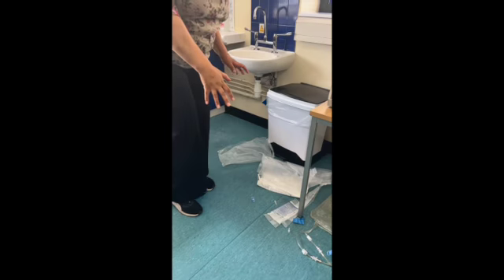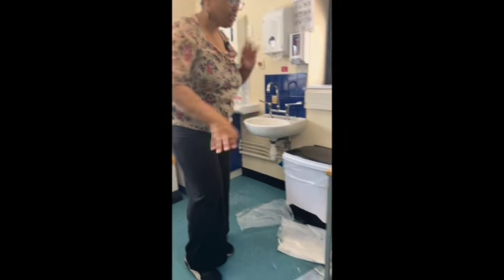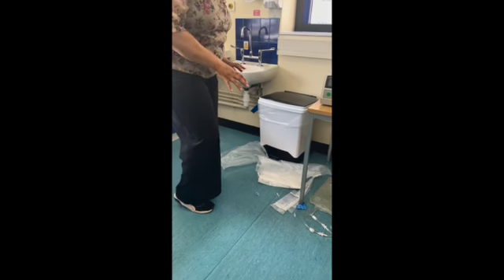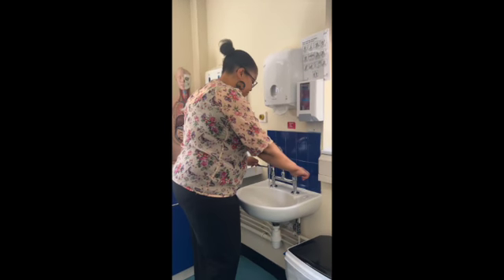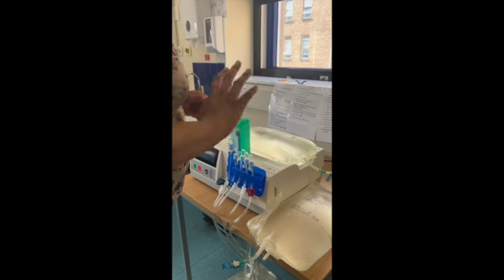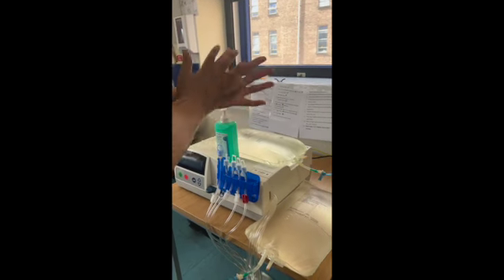So now I'm going to clear the rubbish up, because I'm going to double wash my hands now, so time to get the rubbish out of the way. So I've got my gel ready, and I'm going to double wash my hands. So I'll be washing my hands for 2 minutes before I connect my bags to the machine. So first of all, I'm going to gel my hands before I connect to each bag.